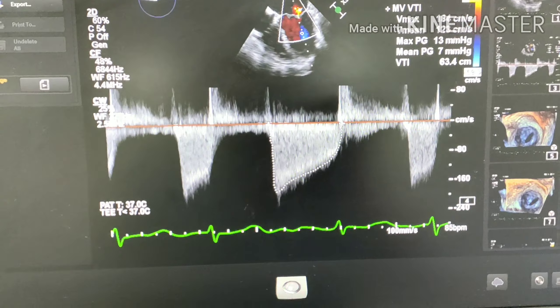The best way to confirm is to use a 3D en-face view of the mitral valve. We got a 3D en-face view and measured the mitral valve area, which you can see is 0.7 cm². On a better 3D zoom of the rheumatic stenosed mitral valve from the surgical en-face view, one more attempt to measure the area gives 0.57, which is around 0.6. So it is a severely stenosed mitral valve with an area between 0.6 to 0.8 cm².